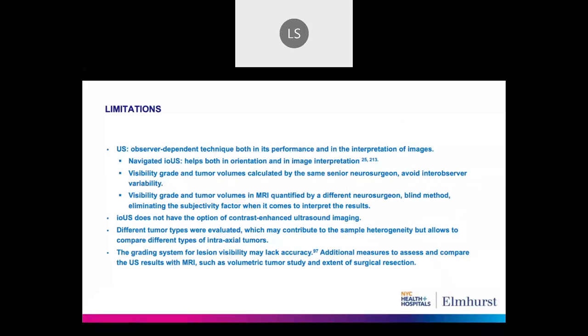We did several things to avoid inter-observer variability, like the person who measured the ultrasounds and the volumes of the tumors and also the grades of visibility was different than the one doing it for the MRI. So we didn't have a bias there.